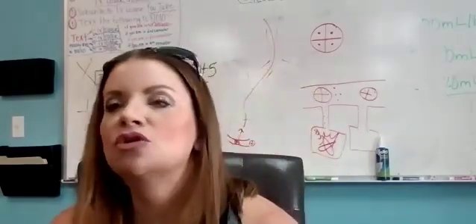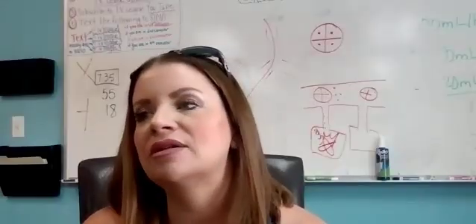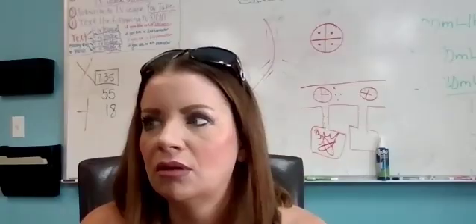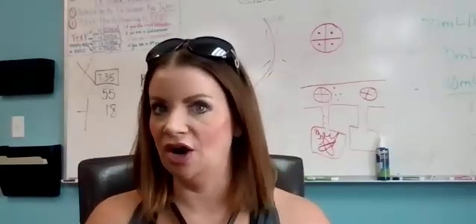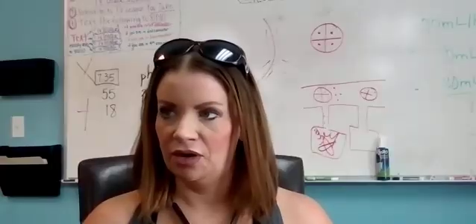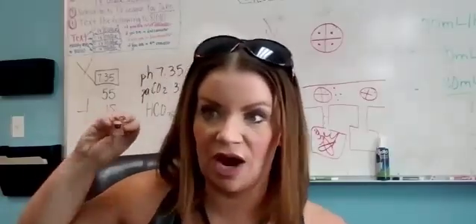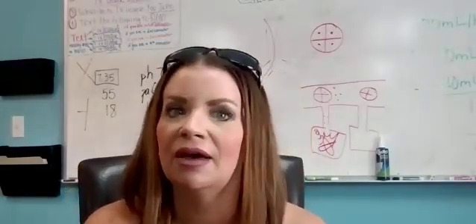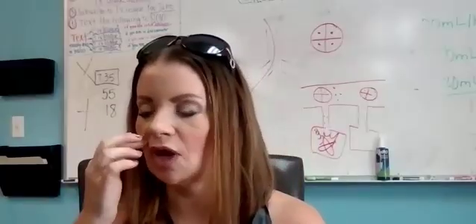Yeah. Okay. So complications of CPAP could be pneumothorax. What's a pneumothorax? A collapsed lung, because there's pressure. Air in the pleural space, which is right around the lungs. Because basically you can put CPAP so high that you blow a lung. Oh no, we don't want to do that. All right. Do you understand CPAP and how it works? Okay.